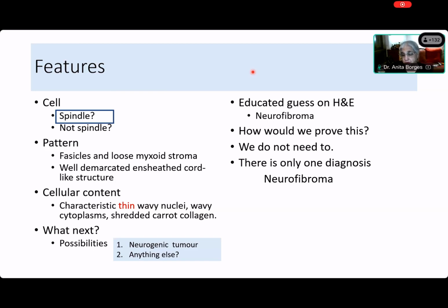There is only one diagnosis, and that diagnosis is a neurofibroma. If anybody does immunohistochemistry on this, they should be shot because they're wasting time, energy, money, and it only tells you that you are not confident of your histology. Okay, so have you understood this, Kedar? It can never be a schwannoma. Why? Because of the characteristic spindle cells we see in this particular case.